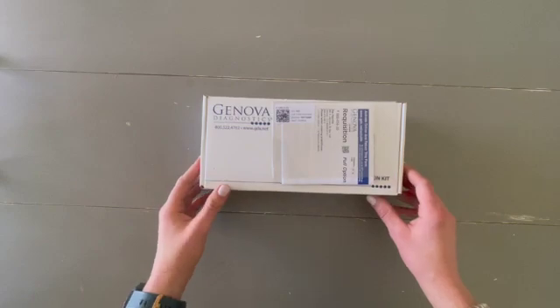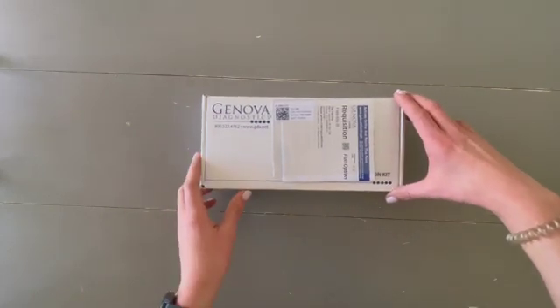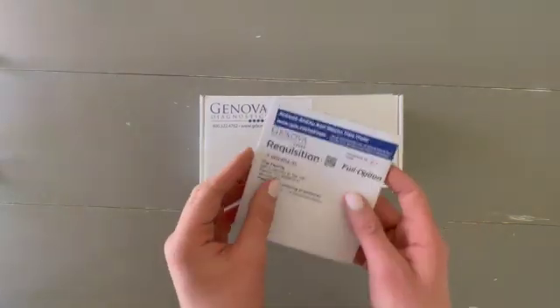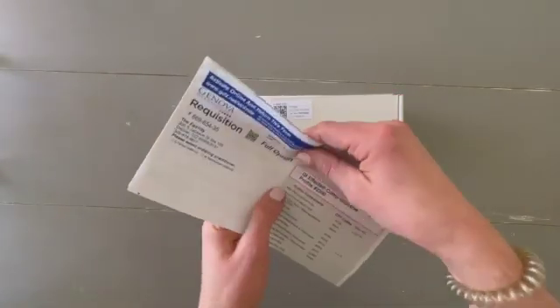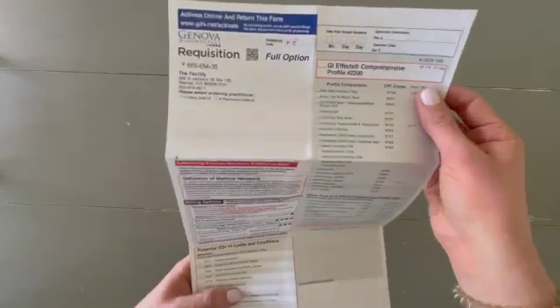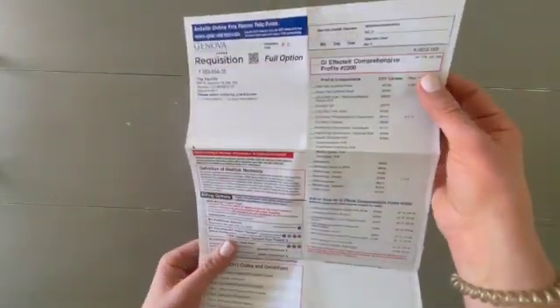I'm going to walk you through an unboxing of the Genova Diagnostics GIFX test. When you receive the box, you'll see on the outside it will have a requisition form. This form has already been completed online when we registered your test and sent it to you, so you don't need to worry about checking anything. Just make sure your name is on this form. You will not be responsible for any more payment — we've already paid for the test when it arrives at your door.